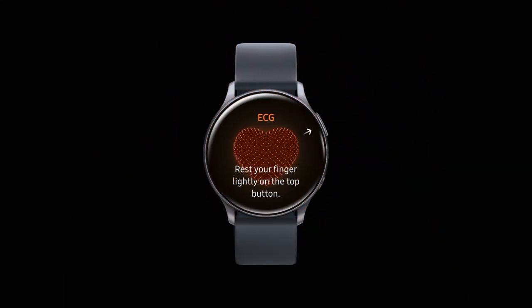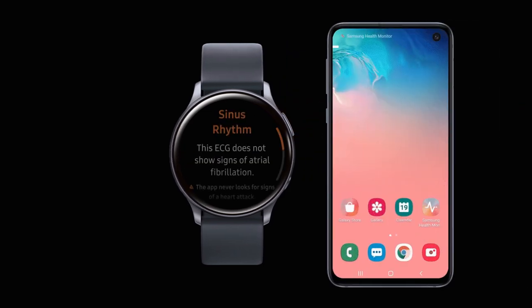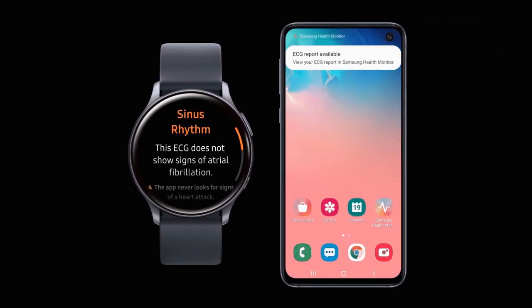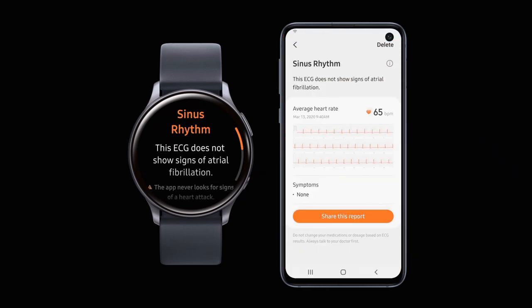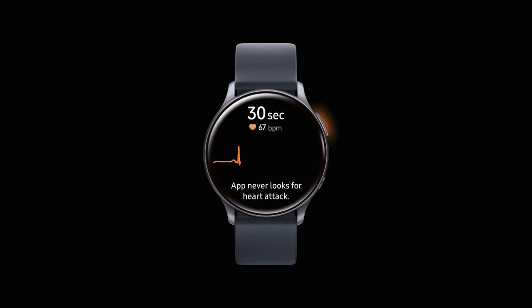As per Samsung, you just have to open the Samsung Health application, sit comfortably, and make sure the watch is fitted firmly on your wrist. You need to rest your forearm on a flat surface and place a fingertip of your other hand on the top button on the watch for 30 seconds. The app will then measure your heart rate and rhythm, which will be classified as either normal regular heartbeats or irregular heartbeats.